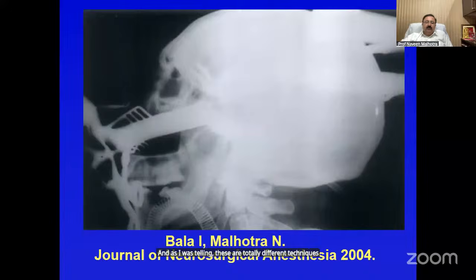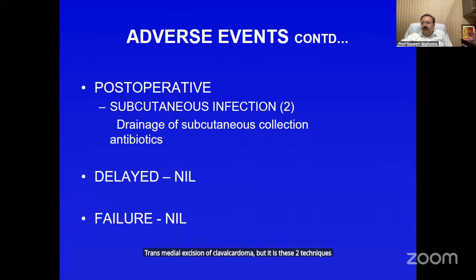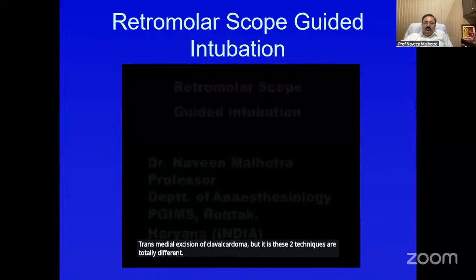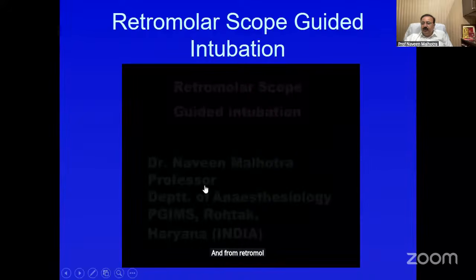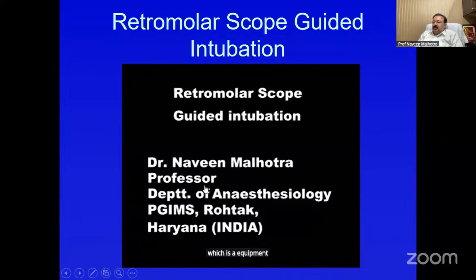And as I was telling, these are totally different techniques. You can use them for facial trauma as well as transmaxillary excision of clival chordoma. But these two techniques are totally different from retromolar scope guided intubation, which is an equipment guided intubation.